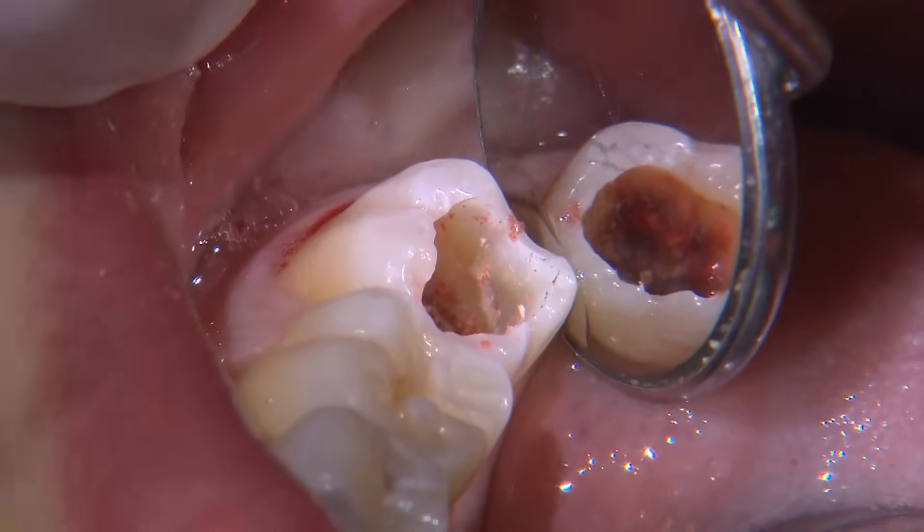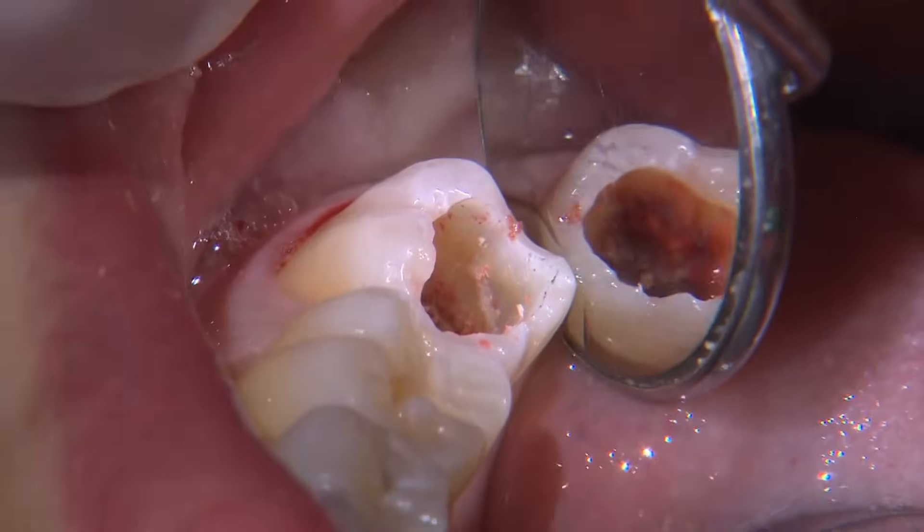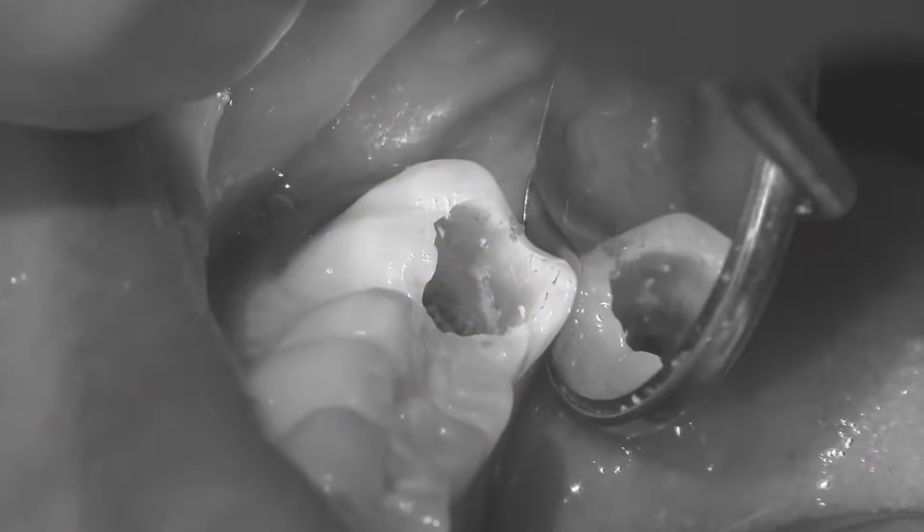I see that there's a crack line through the distal marginal ridge, but since there aren't any signs of leakage or decalcification, I like to bond directly to these areas.